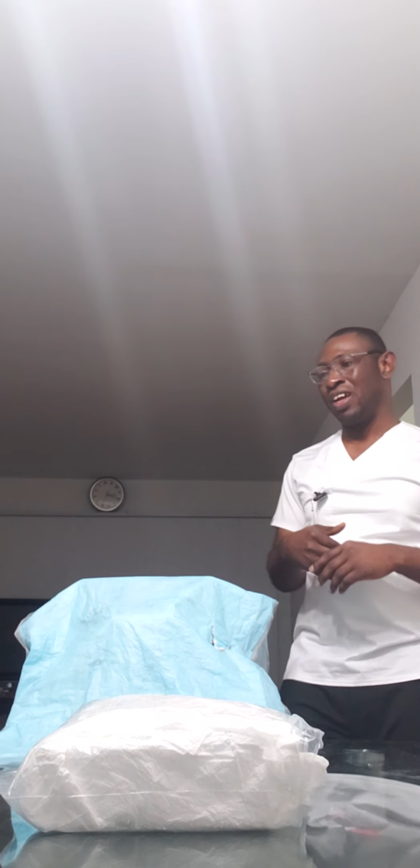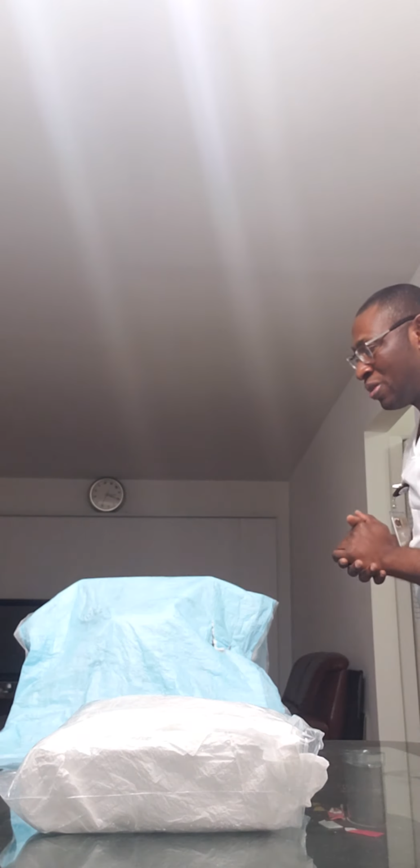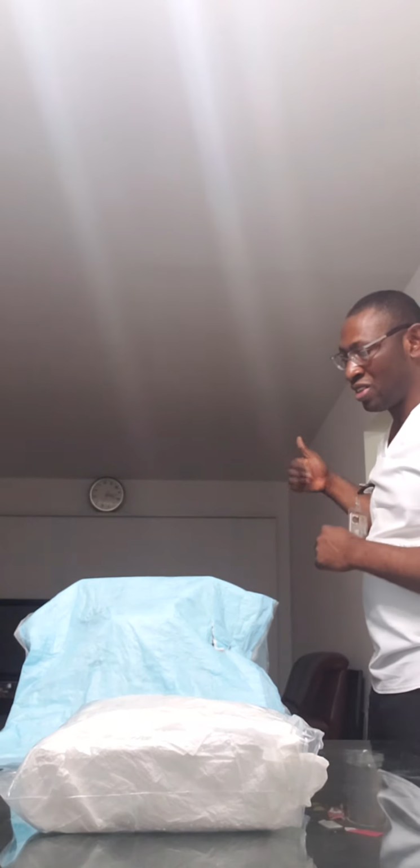And could you help me confirm the last time you urinated? Oh, great. And did you feel like you emptied your bladder? Okay, all right. So the first thing I'm going to do, do you want me to go ahead with the procedure? Okay, that's good. Thank you. I'm going to call one of my colleagues to join me to assist me, okay?